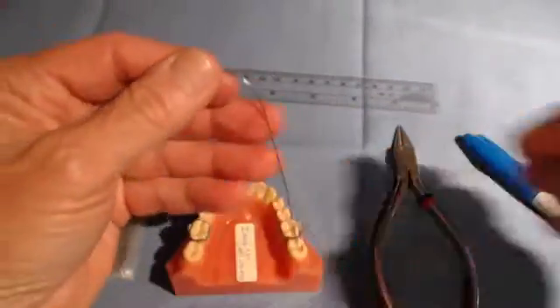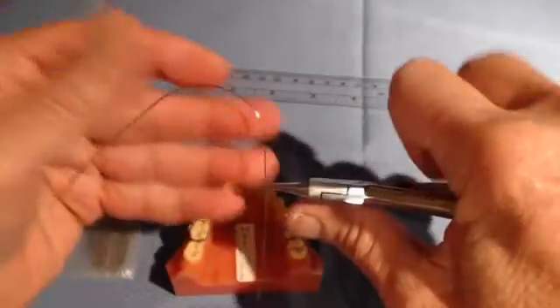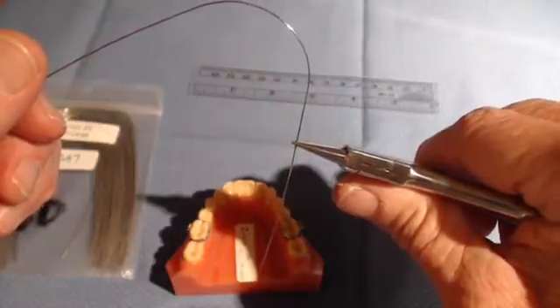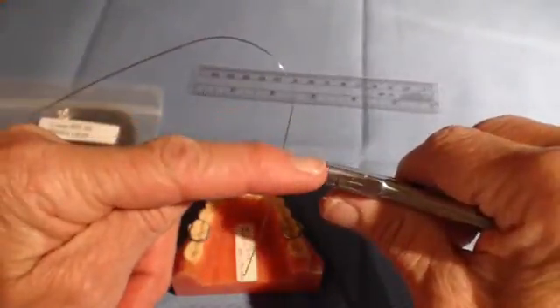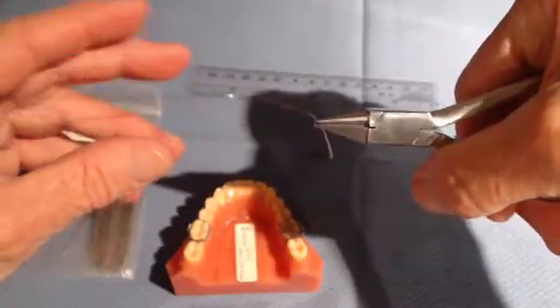I will remove the wire, placing the light wire plier on top of that mark with the round beak on top. Notice how close I am to the end of the plier because these bends need to be small. From basic wire bending skills, notice that I am perpendicular to a tangent on the curve, and in this plane of space, I am parallel to the occlusal plane. I'm going to hold this very tightly.